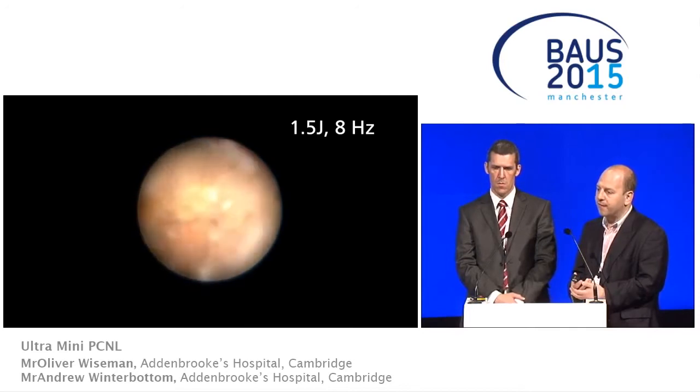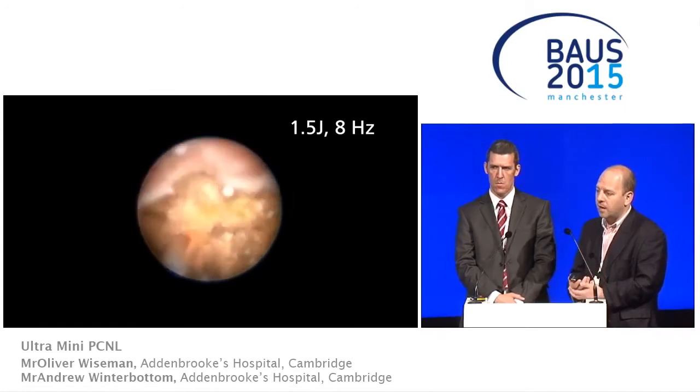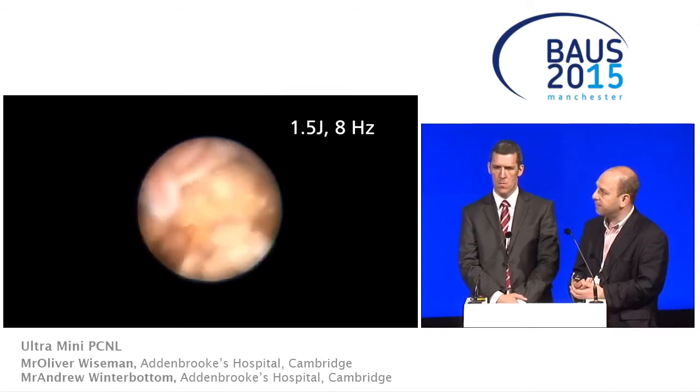But you can't wash the fragments out using the ultra mini PCNL, so it's basically the same concept as a flexible ureteroscopy. You'll fragment the stone, and if you're not going to pick the fragments out, which you can't do, then they're going to have to clear naturally.